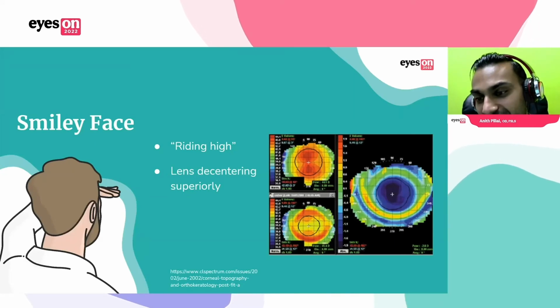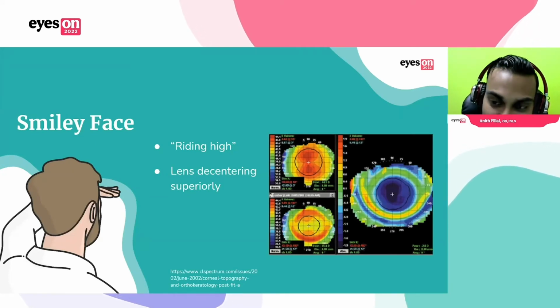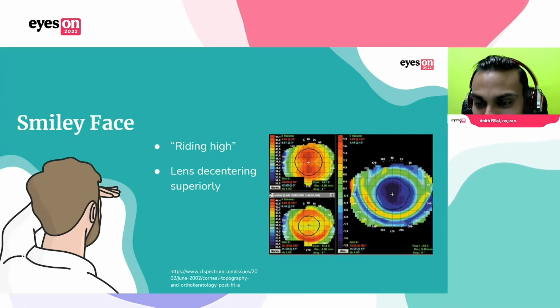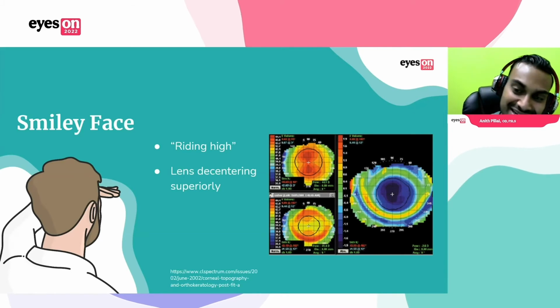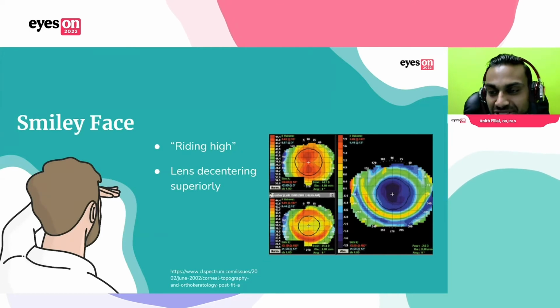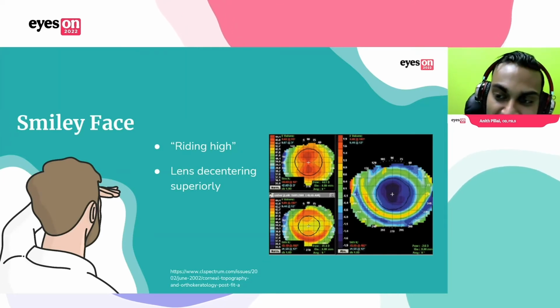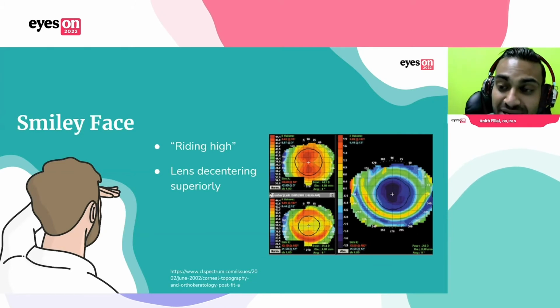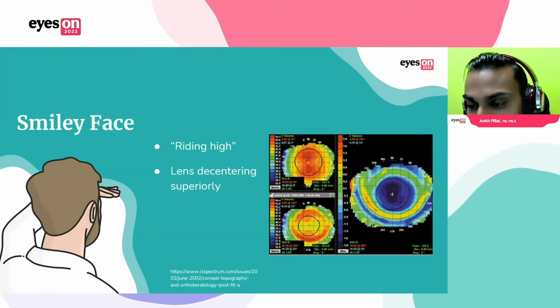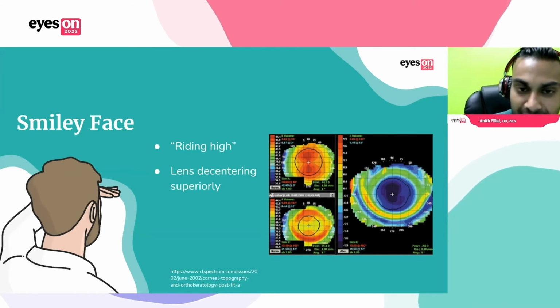You can see on the map on the right this yellow-orange area underneath the blue circle, and it looks like a smiley face. That depiction happens because the lens is riding high and it's causing a superior decentered treatment zone. So you're going to see some of that reverse curve underneath it, but the reverse curve superiorly is out of the image, so you'll see what looks like a smiley face. So all a smiley face topography means is superior decentration.